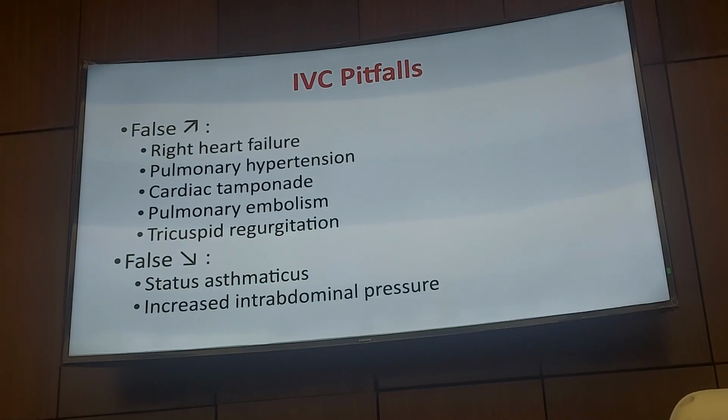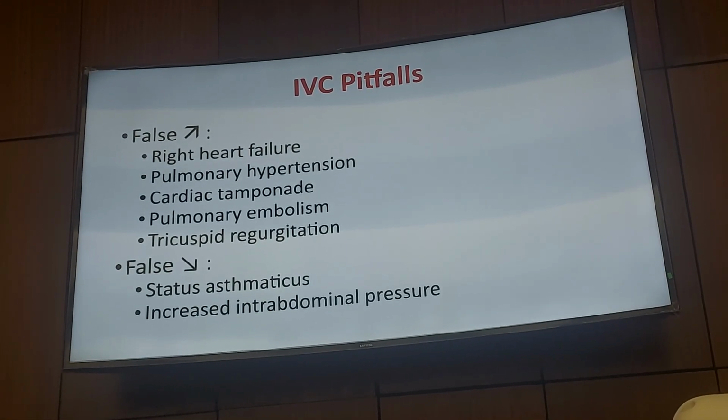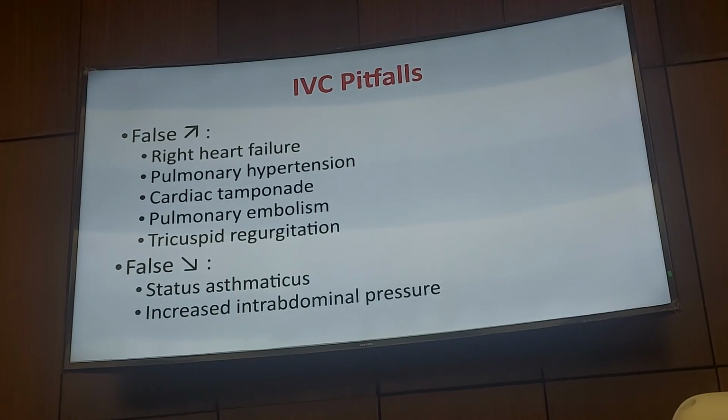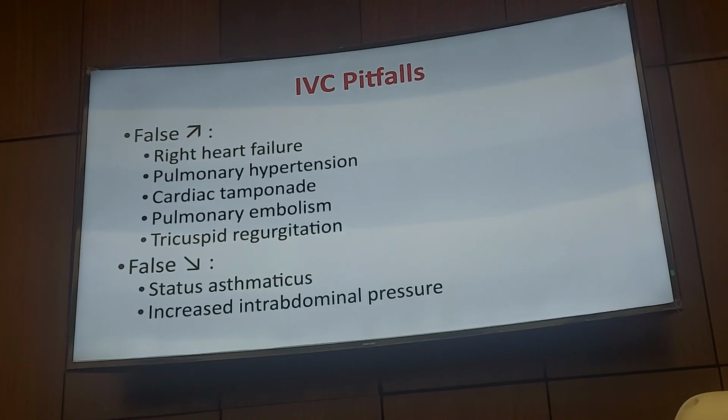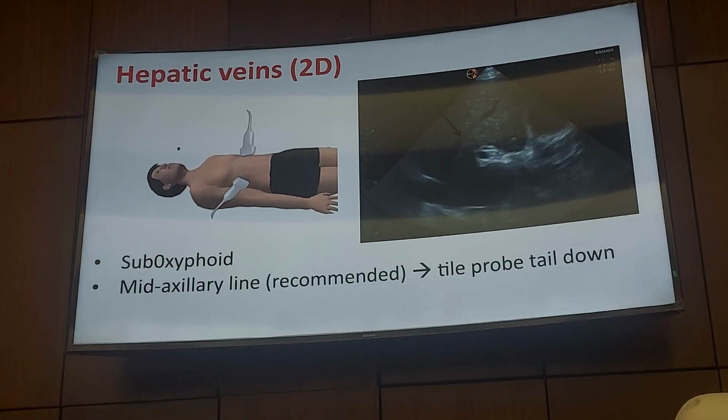And you can even have dilated IVC in young and healthy volunteers, especially athletes, without pathology. You can also have a collapsed IVC in a congested patient. Examples could be increased intra-abdominal pressure. It could be pregnancy. The gravid uterus can compress the IVC. So the diameter itself is important, but it's not enough. And that's why we need to do the further steps.